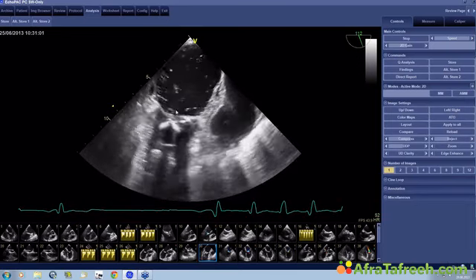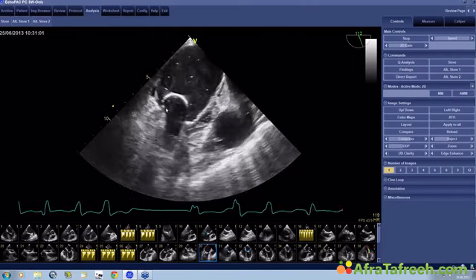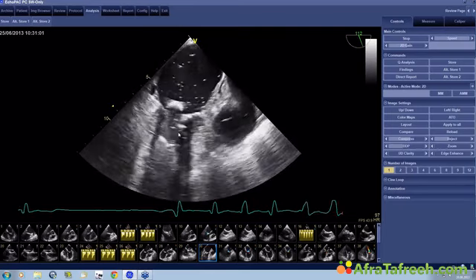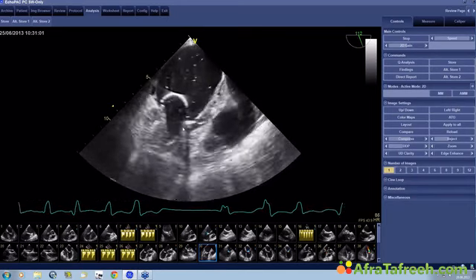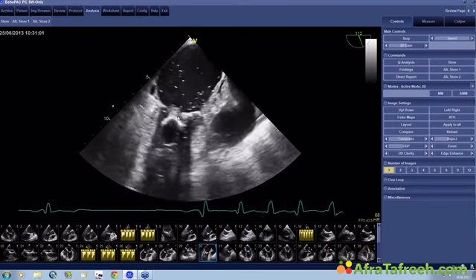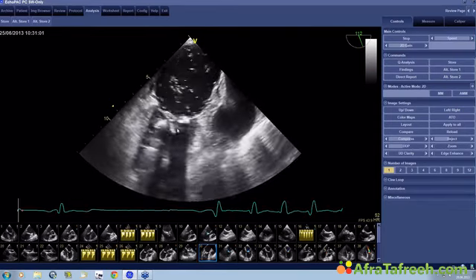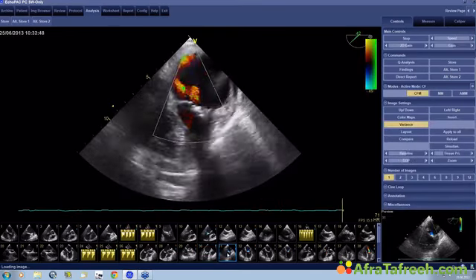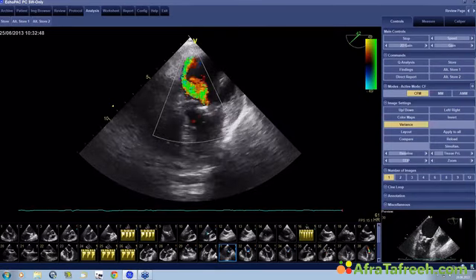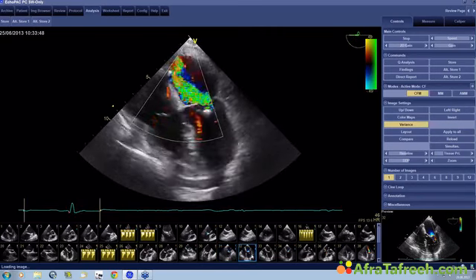The balloon expands right at the region where we have the mitral valve, and the idea is to pop the mitral valve and thereby cause the mitral valve to expand. And this is what we did, and you can see that at the moment we do this, the balloon also popped because of the calcification that we have. You see that there is contrast all of a sudden coming from the balloon. But we were able to pop the valve, and then after that what we usually do is we look at the echo and mitral regurgitation. And this is what we found after the procedure.